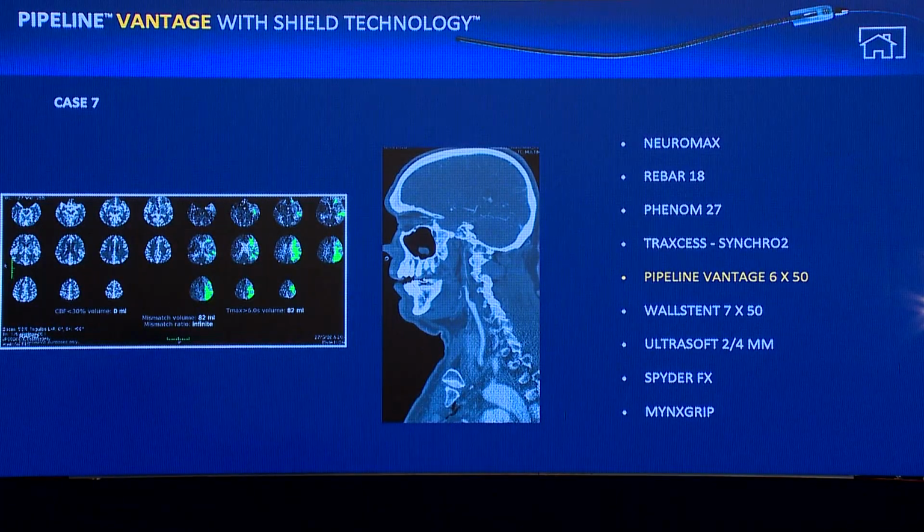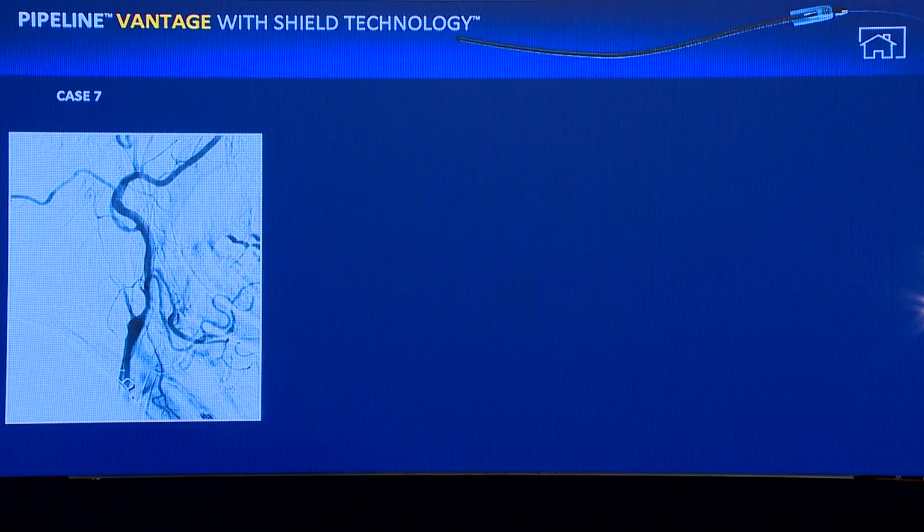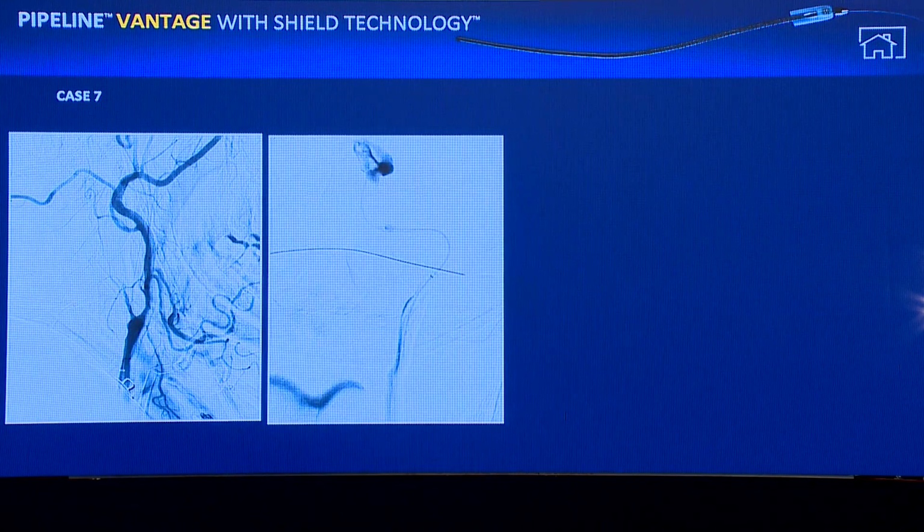With another Vantage. Another indication of the label that we use this kind of stent, especially the biggest one, is in dissection when we face a patient with acute ischemic symptoms, like one coming from thrombectomy, for example, and we need to treat the dissected carotid artery. Of course, we have to allow the use of antiplatelet therapy. But we started to use this strategy, not in all the cases, when we are facing a very banded artery with a huge amount of clot.